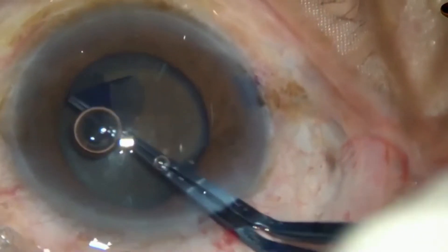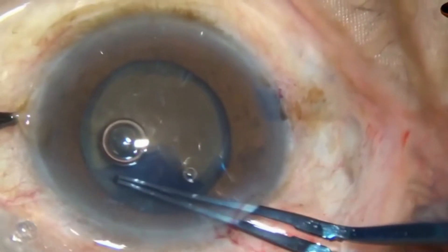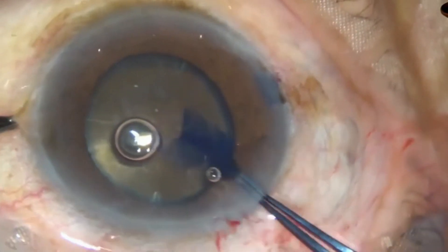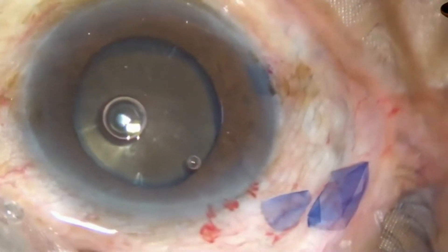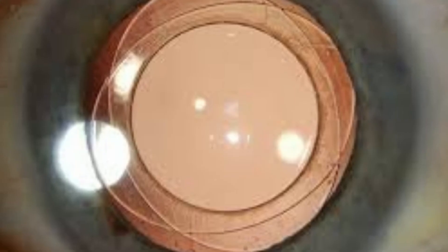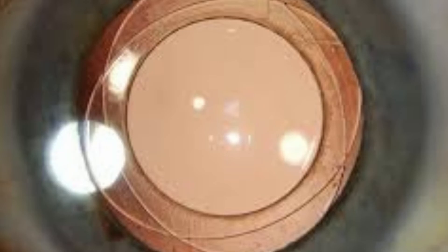Compared to other techniques of capsulotomy, CCC is considered to be stronger because of the continuous smoothness of its edges. The architecture of capsulotomy greatly influences the position of the lens and subsequent refractive outcome. A perfectly circular and properly sized capsulorrhexis allows the capsular bag to completely envelop the optic, providing a more predictable effective lens position and optimal refractive outcome.